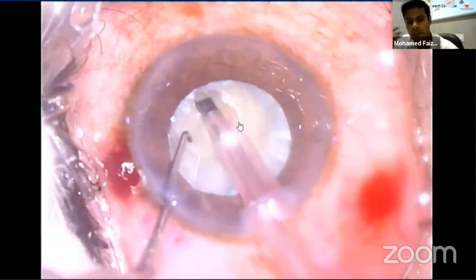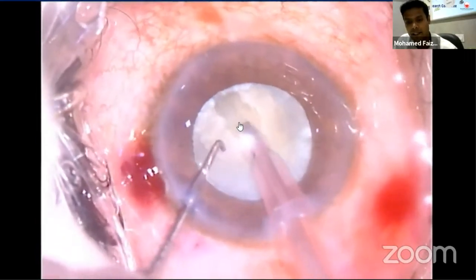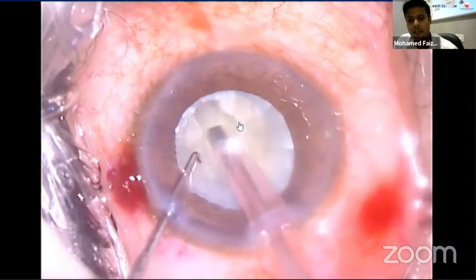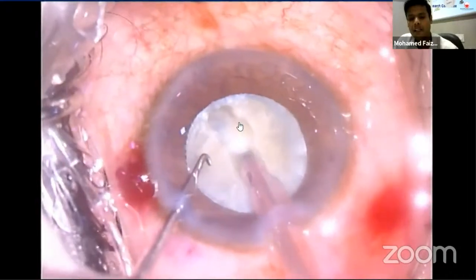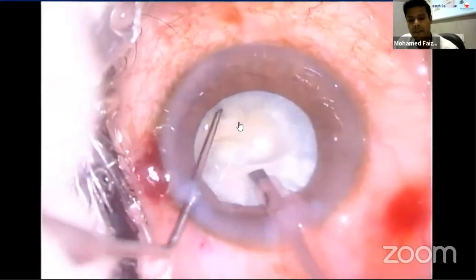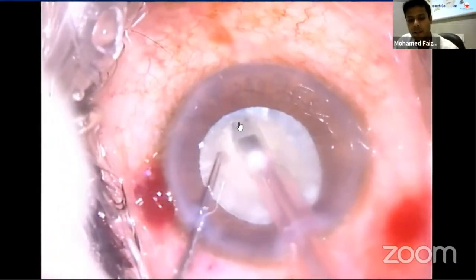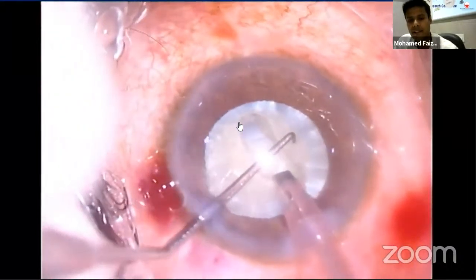During each sculpting motion, the morphology of the lens should be kept in mind. That is, the downslope sculpting initially should be followed by upslope sculpting beyond the center of the nucleus. The ultrasound power should be used only during forward movement of the tip, and the foot pedal should return to position 1 during reverse movement. On the distal side, the nucleus can be sculpted slightly further towards the periphery, but under the site of the entry wound, the groove cannot extend as far due to the capsular rim and angulation of the phaco tip. So the nucleus is rotated and the groove is extended.